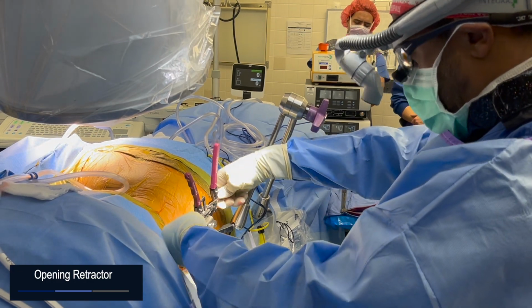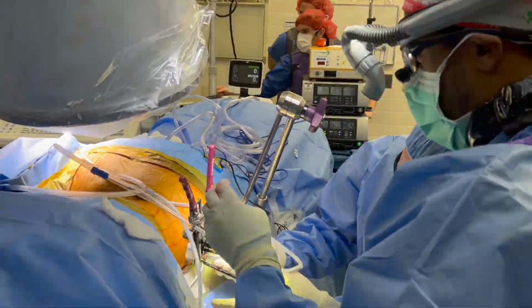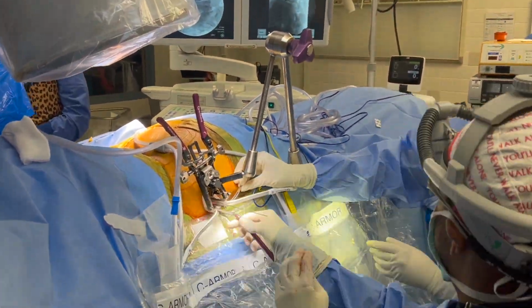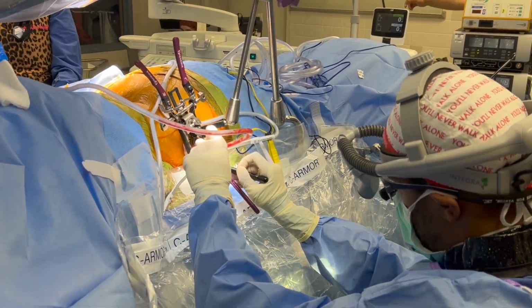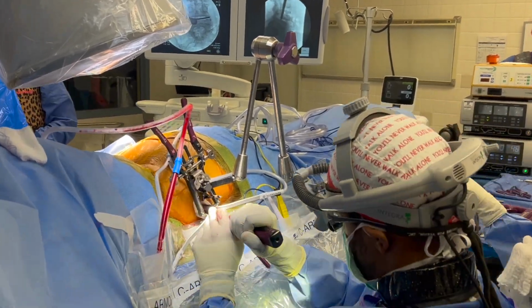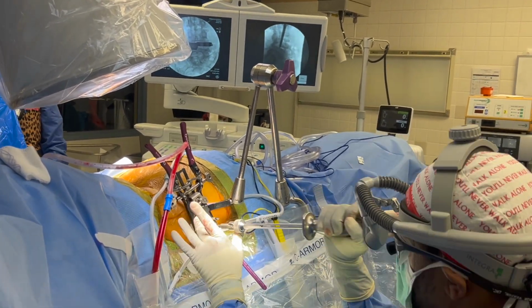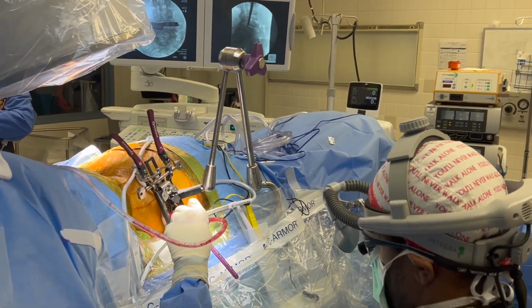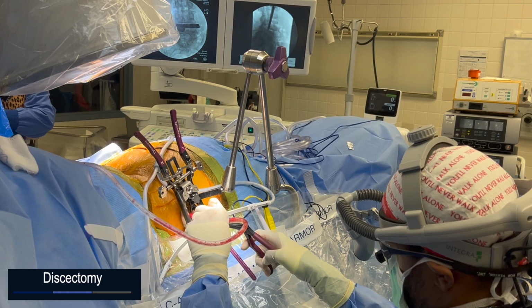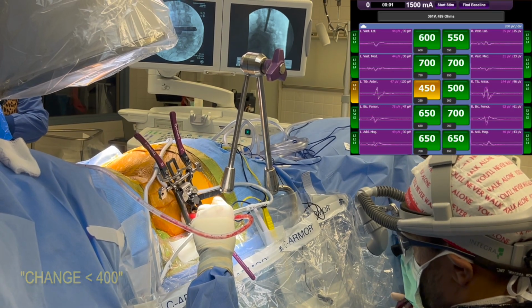Run a TMAP again, please. TMAP. And baseline. Run a TMAP. Okay, change less than 400. Same as last run.